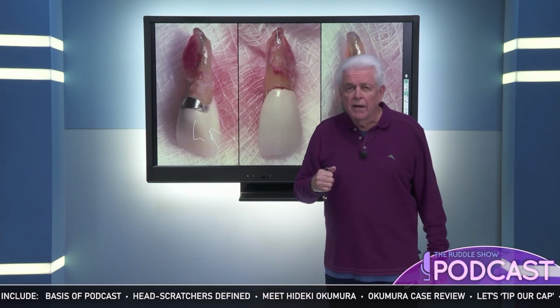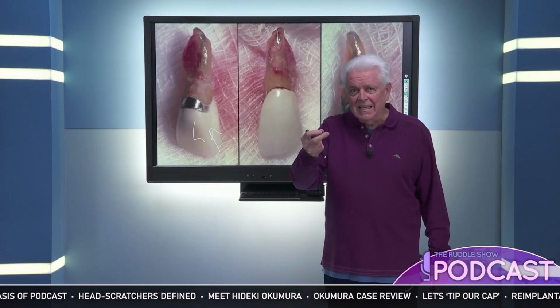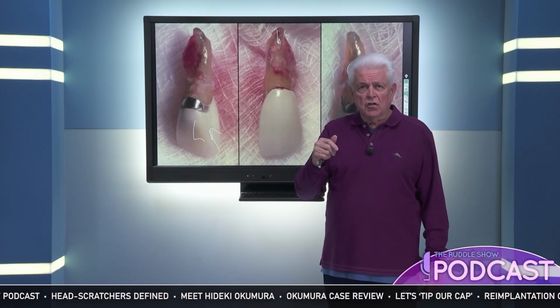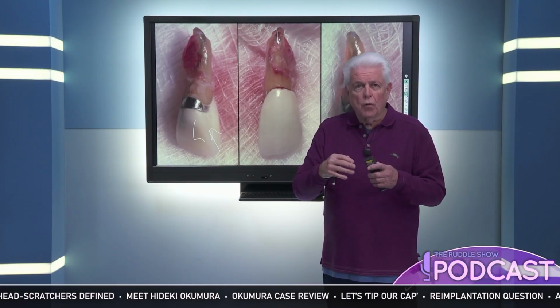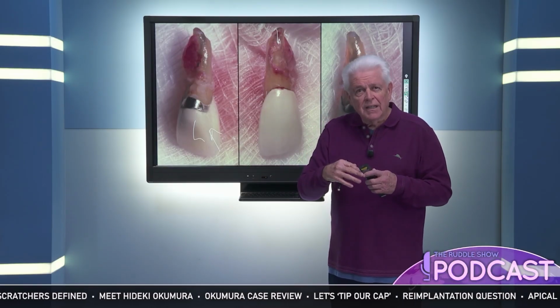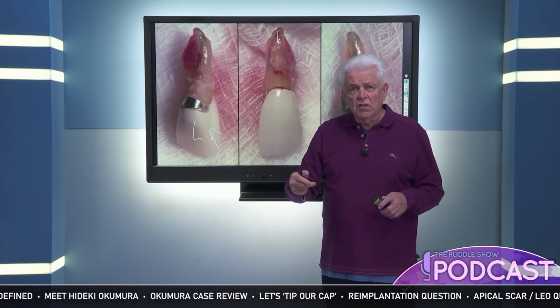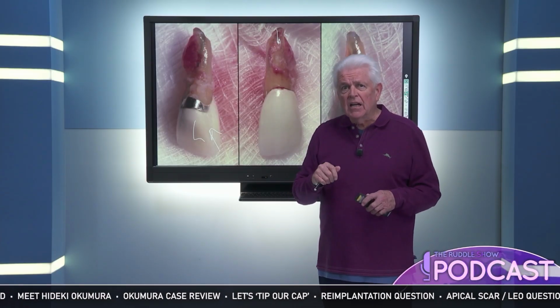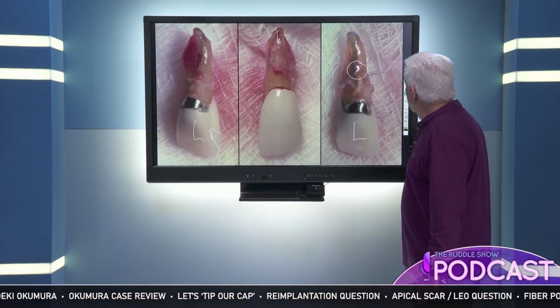Remember your assistant the whole extraoral time. She's dripping continuous flow Hank's salt solution. You got to keep the tooth moist, wet. You got to keep the PDL fibers alive. You don't want dehydration. So the assistant is faithfully irrigating constantly while we're doing the extraoral work. All right.